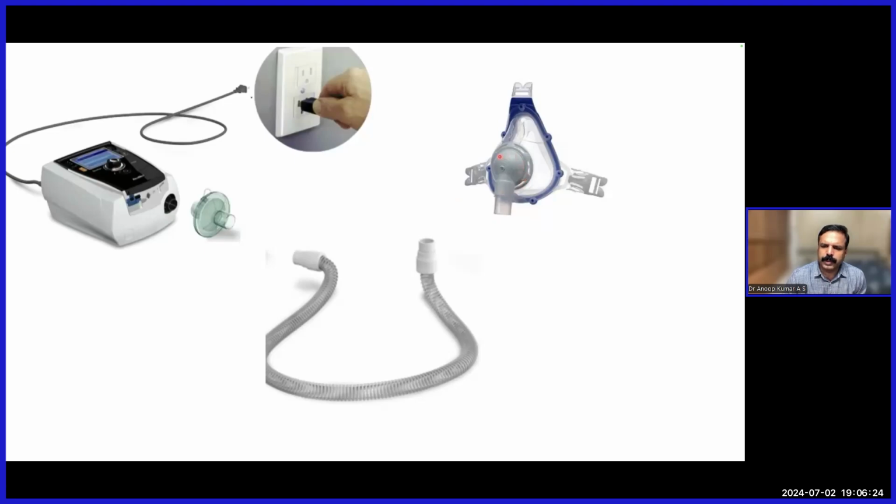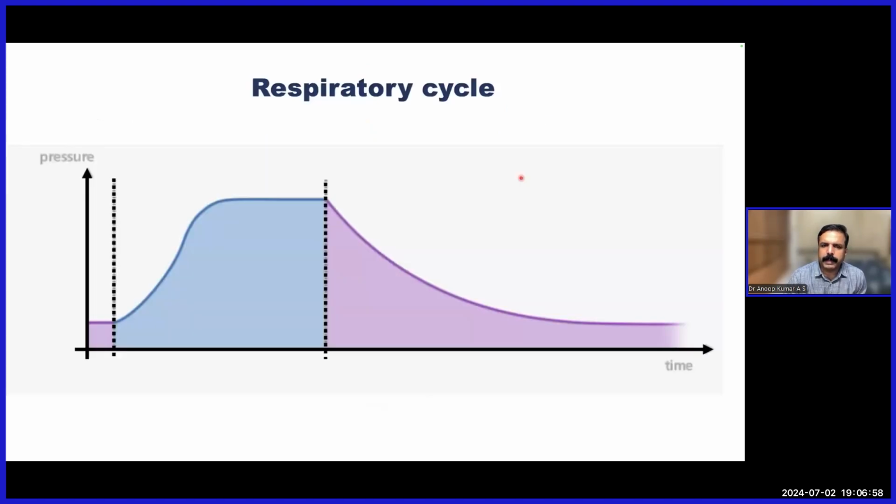So what you can do is use a non-vented mask here, so there will not be any leak. Then you put a combined HME viral filter here. Then after that, you can connect a leak port. Clear? So first the non-vented mask, then the filter, then you use a leak port. So the gas coming out through the leak port will be filtered through the filter you are keeping here, and will have lesser viral or bacterial content. So that is the way you can reduce the pathogen load in the exhaled air.